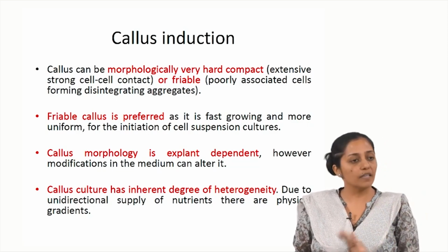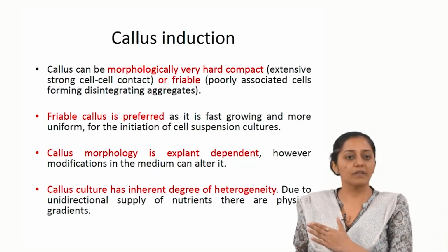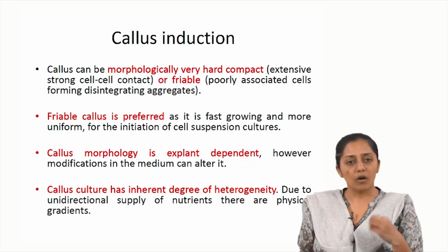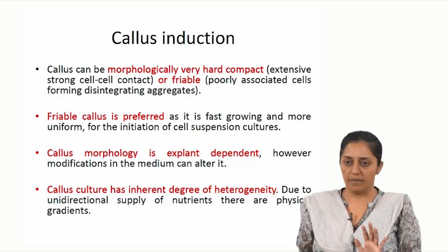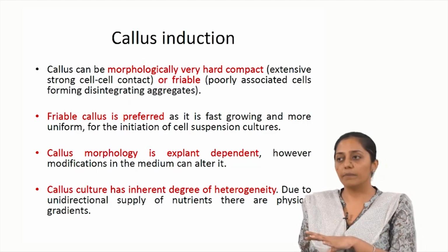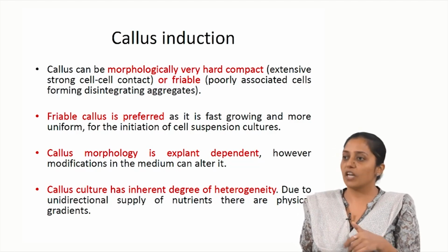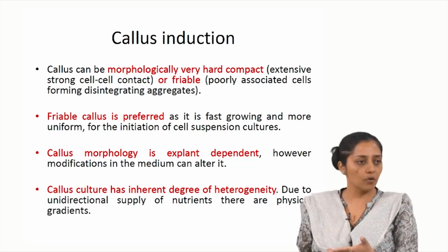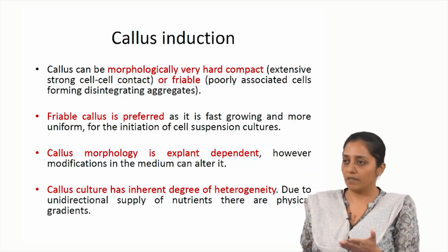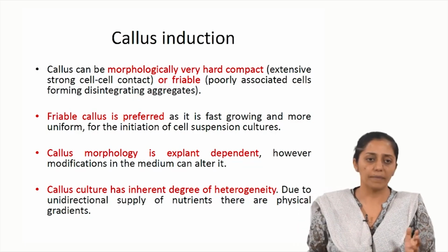Now if you need a synchronous culture and all cells giving you reproducible results in terms of productivities, then all cells have to be given the same environment. So if the cells get dispersed in the liquid medium, all cells are getting exposed to the same environment. So the chances are high that the culture would be synchronous in nature, and then the mass transfer limitations which you were referring to will also be overcome to some extent.